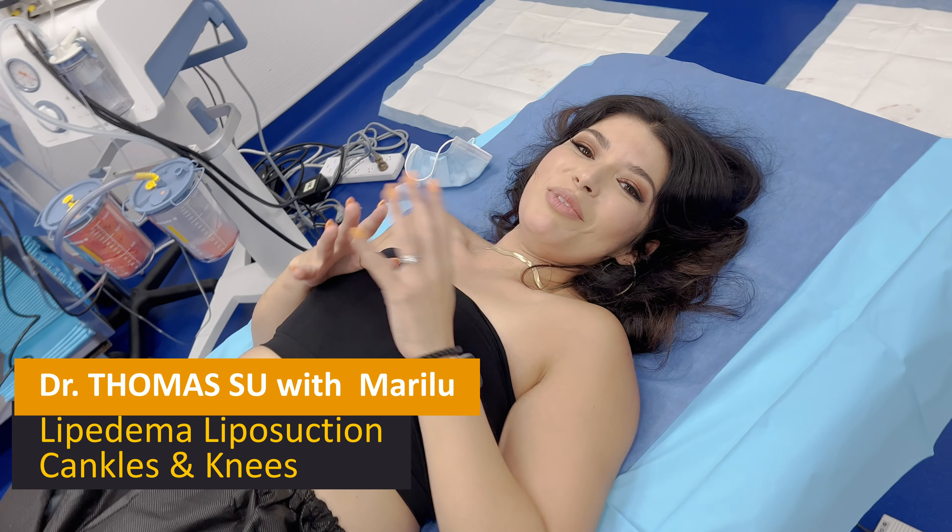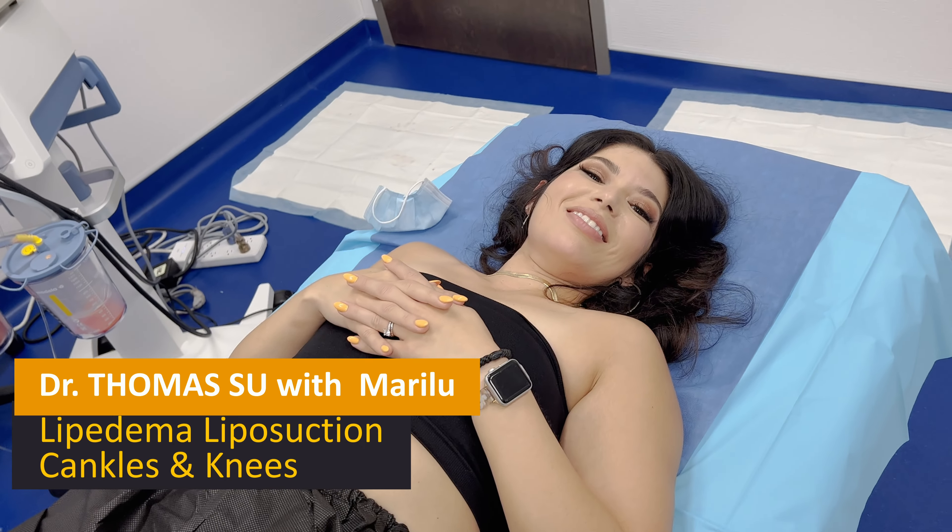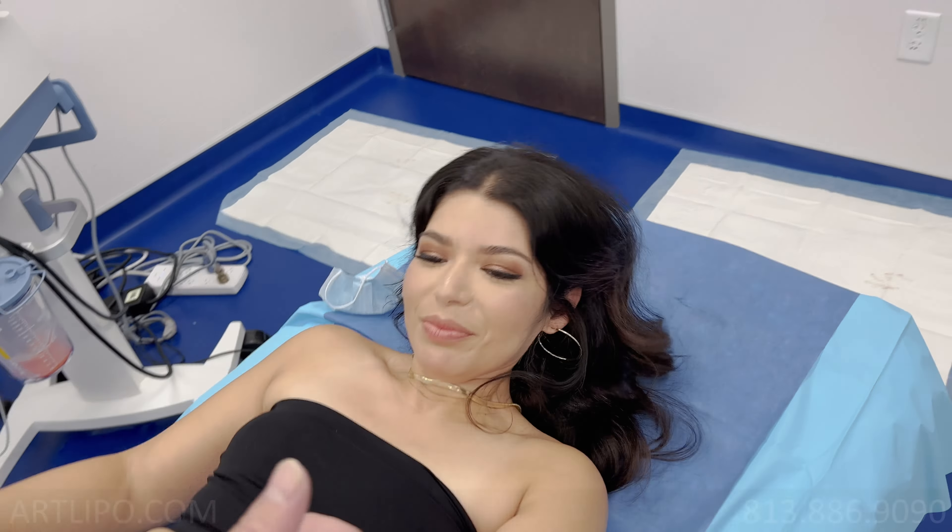Okay, hey Mari, how are you doing? Hi, I'm doing good. Mari's here for Lipoedema treatment and we're doing her lower ankles, calves and knees.